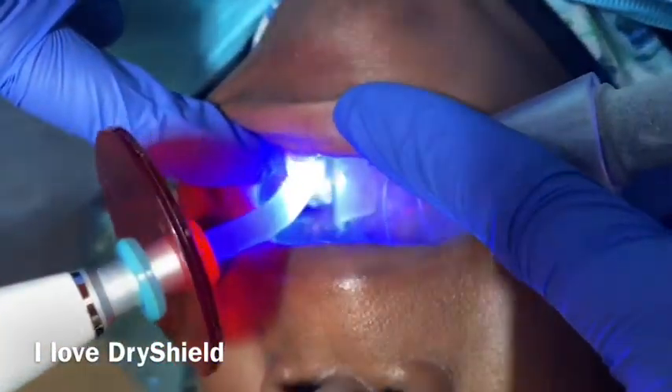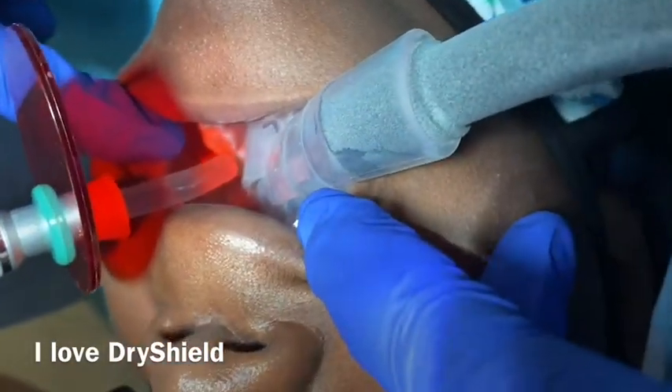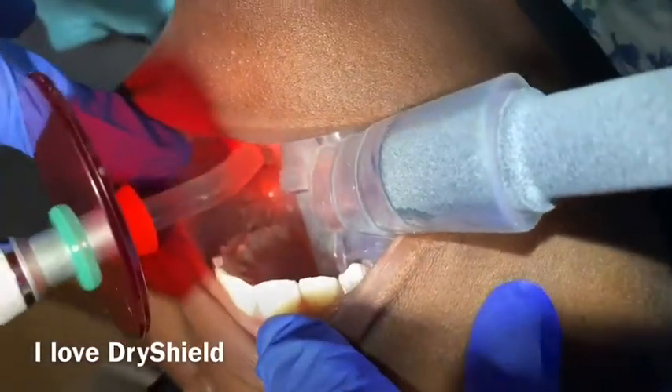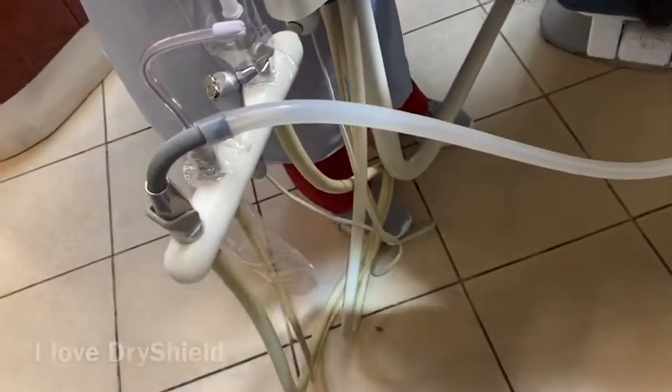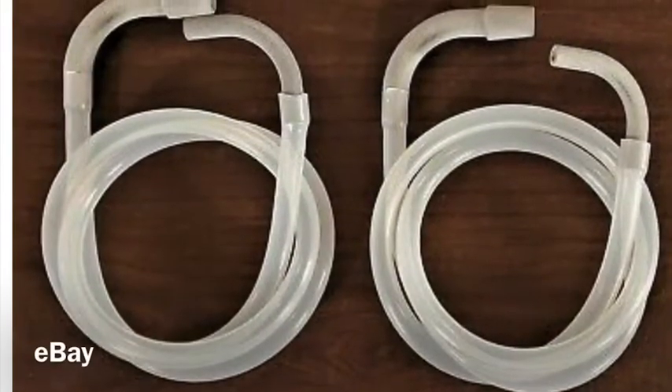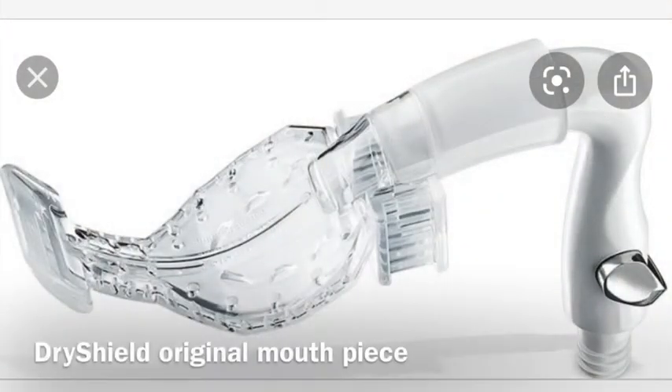You should buy it and use it — you're not going to regret it. It's very affordable if you just buy that part and then buy the attachment from eBay. This is how it looks: the attachment is from eBay, but the DryShield inside the patient's mouth is the original. Just want to share with you guys — have a good day, thank you, bye!